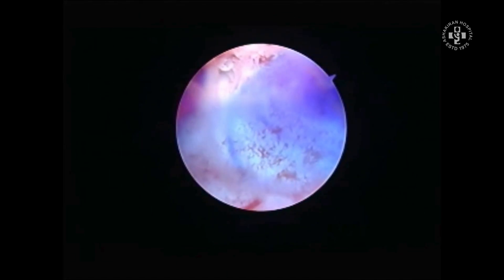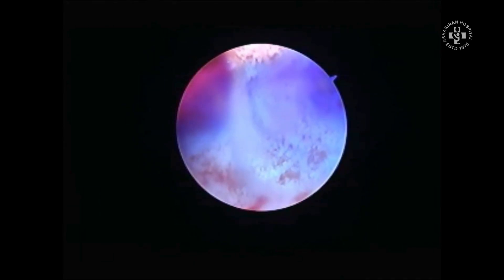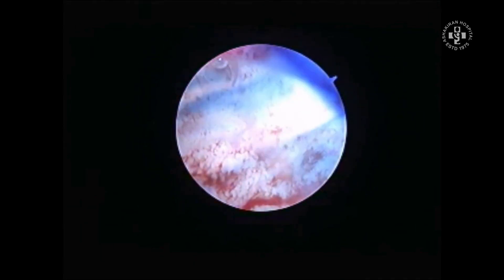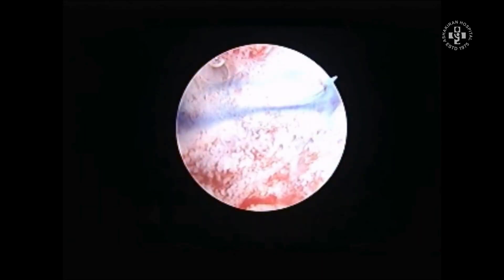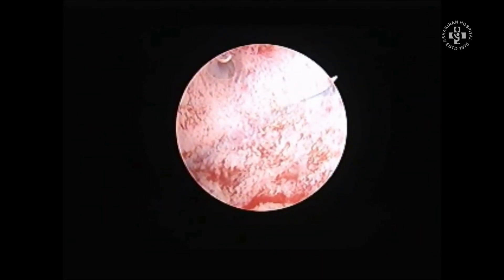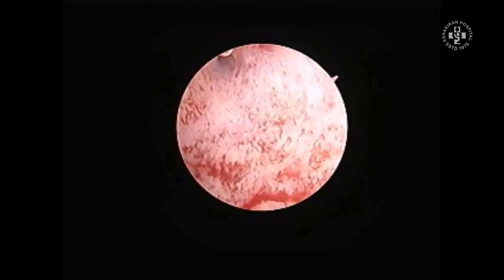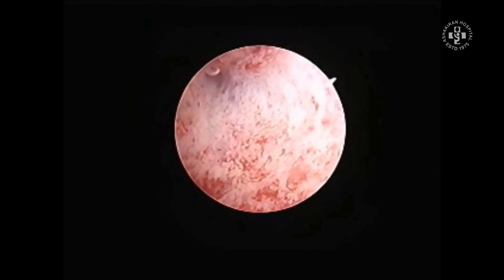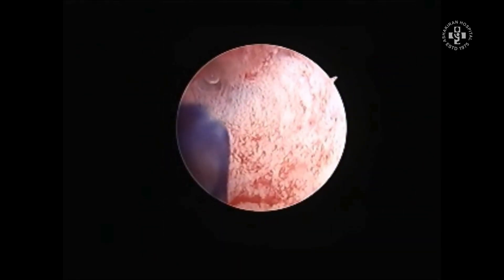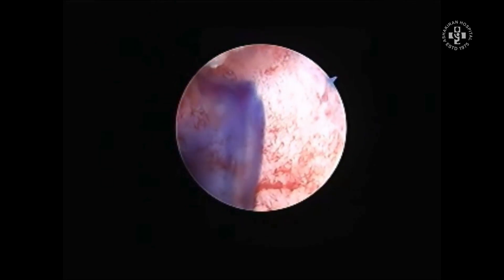This can all be documented by just doing office hysteroscopy. The patient does not require any anesthesia, and the comfort of the patient is very good because the patient herself can see the tubal functioning, the ostia, and the uterine cavity. This is one of the great things about assessing the tubes by doing hysteroscopy from the uterine side.